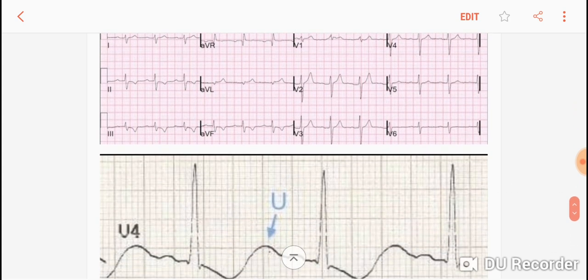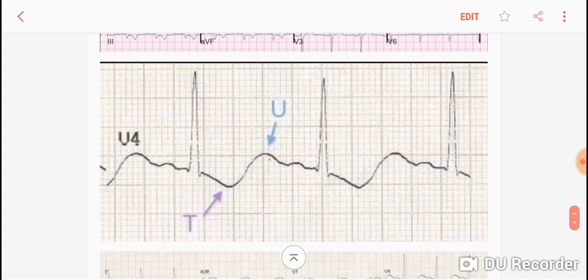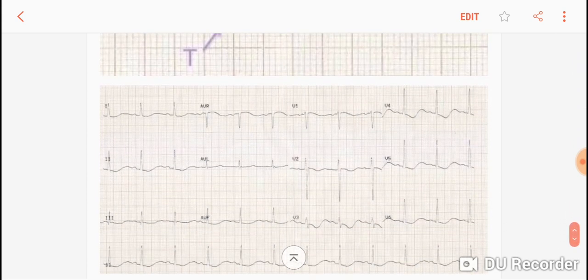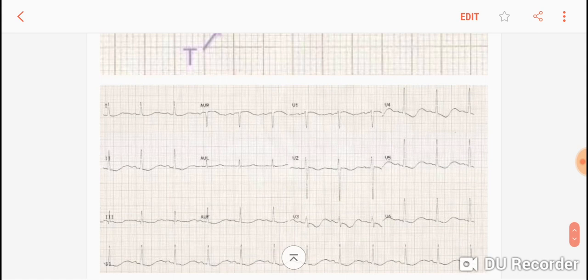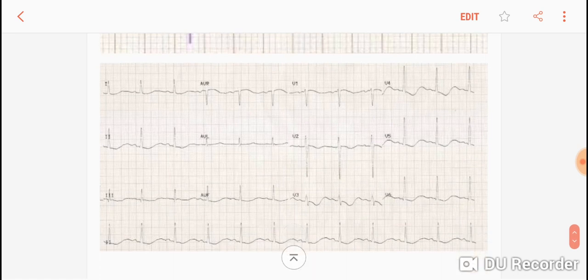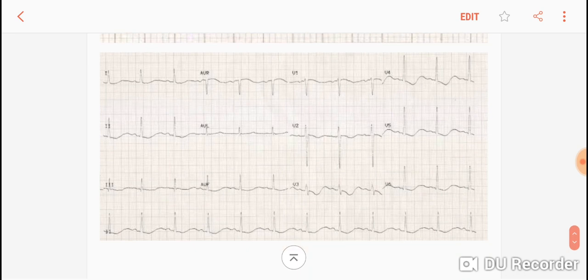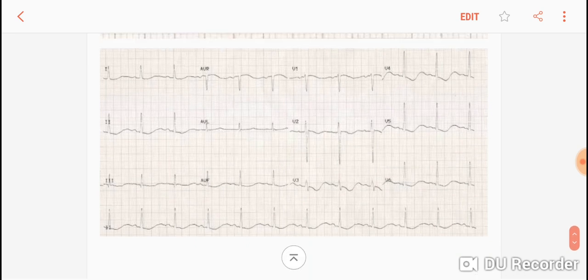We differentiate from hypokalemia. In hypokalemia there can be ST depressions or T wave inversions and U wave formation after T wave. In that you will have in all leads ST depression or T wave inversions. So I hope you guys know how to diagnose an NSTEMI.